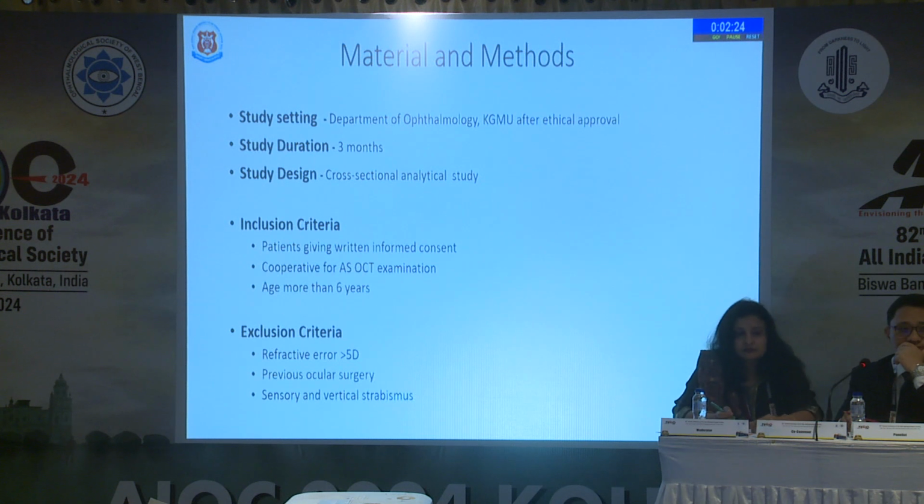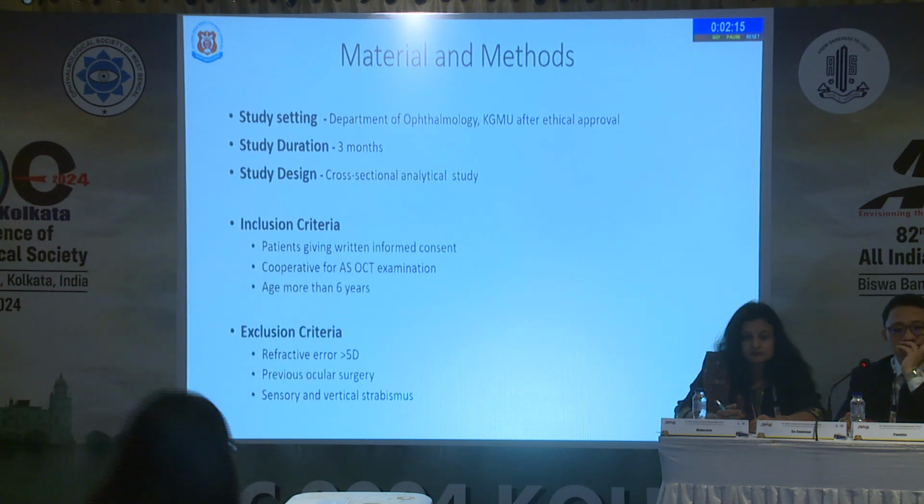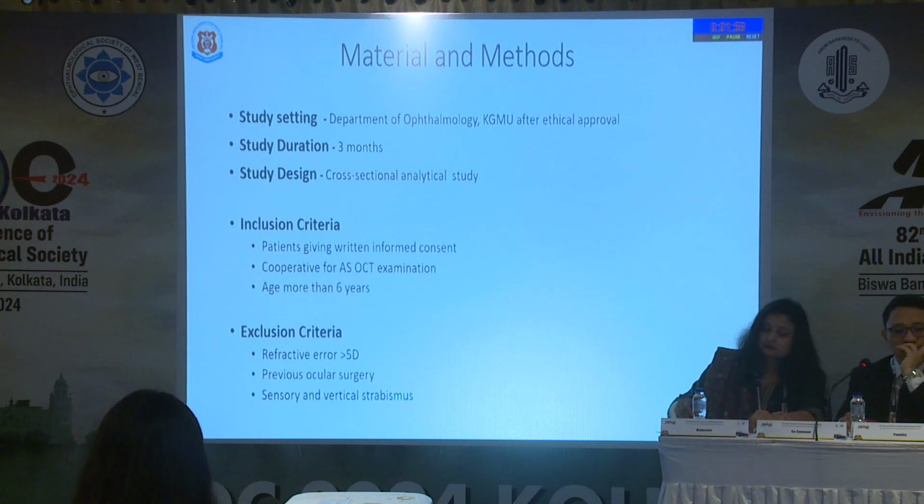Study setting: Department of Ophthalmology, KGMU, after ethical approval. Study duration was 3 months. Study design was a cross-sectional analytical study. Inclusion criteria were patients giving written informed consent, cooperative for ASOCT examination, age more than 6 years. Exclusion criteria were refractive error more than 5 diopters, previous ocular surgery, sensory and vertical strabismus.